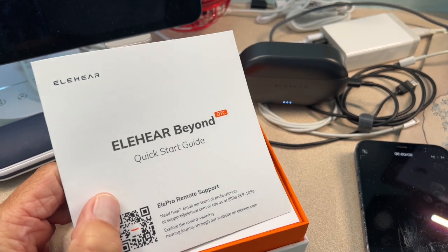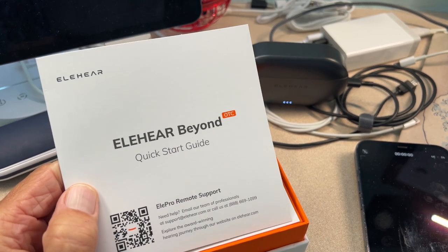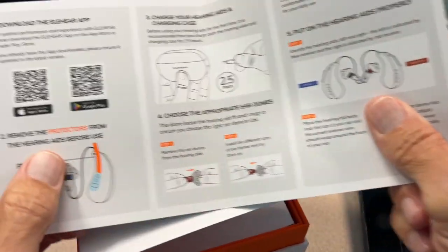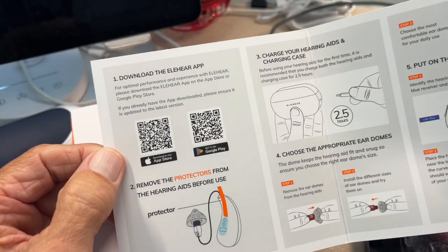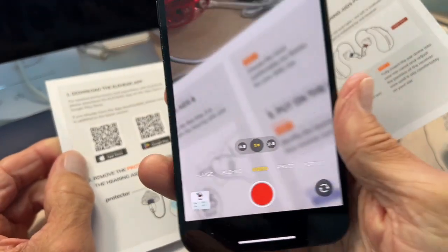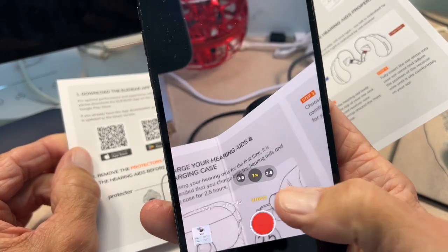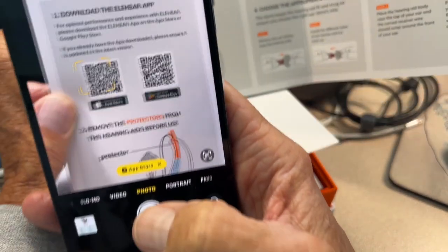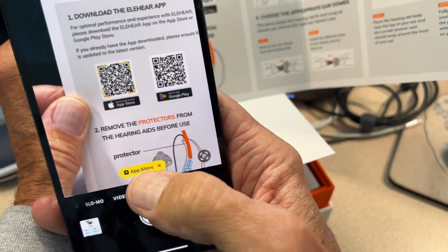Okay, so in this video I'm going to show you guys how to download the app for the ELEHEAR hearing aids. Alright, so we got to go to the Apple Store, right? So we're going to go ahead and get our phone, and we're going to go ahead and go to Photo, because you always got to do Photo to get to it. And then we're just going to get on there like that, and it just basically picks it up.